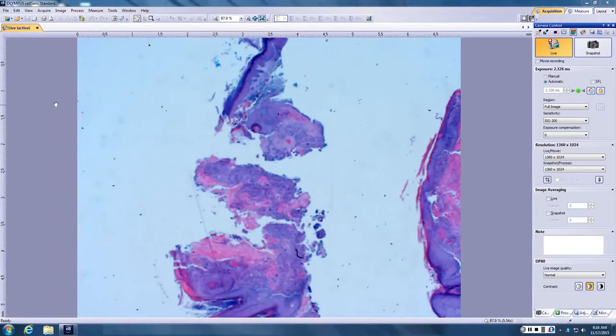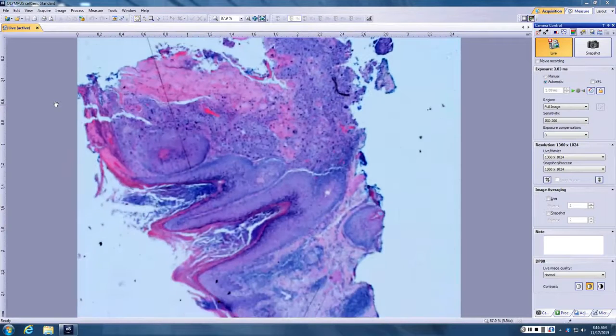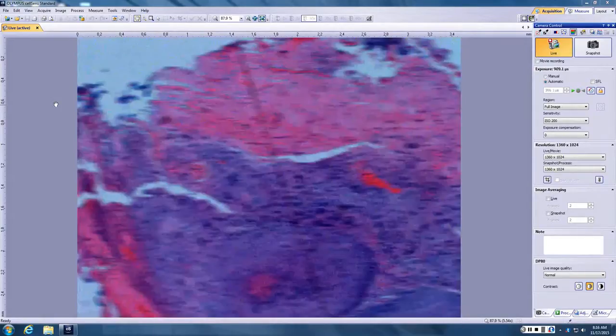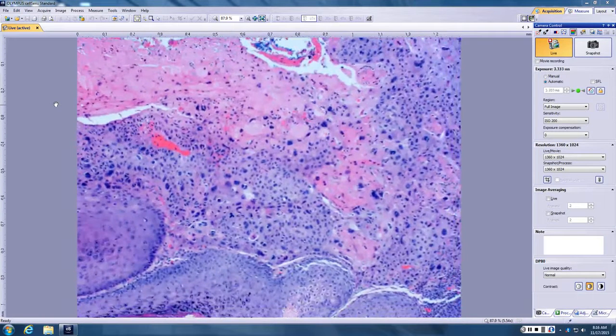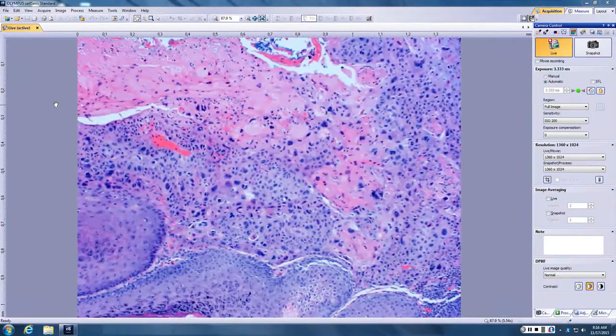So, just from scanning power, we've got a large, atypical, acanthotic area with a central area that looks to be necrosis. Agree. Compare these cells to these cells. Which cells would you rather have? I'd probably choose the second choice. Probably the ones that are not overtly malignant.